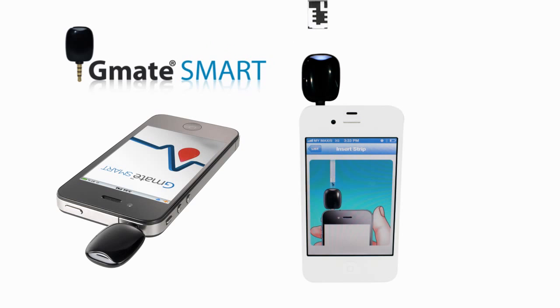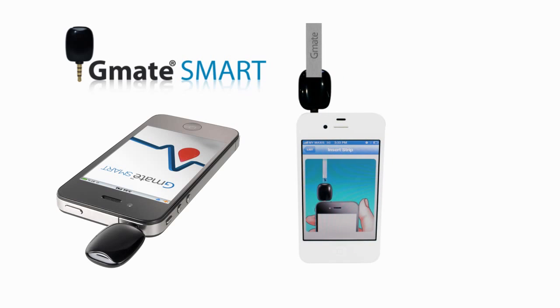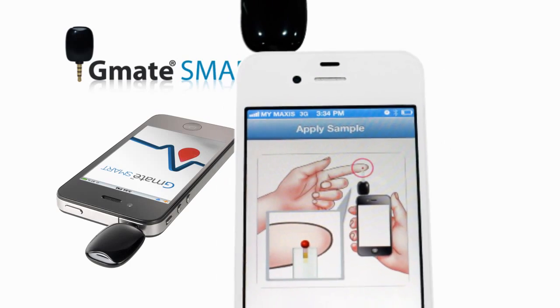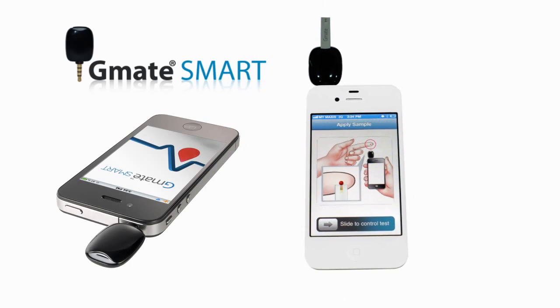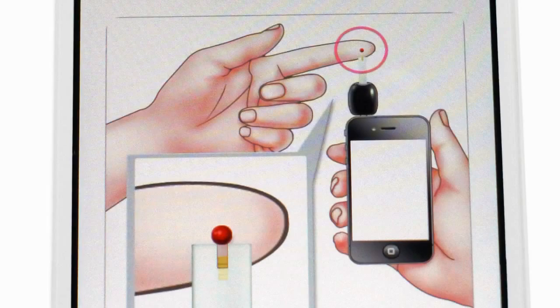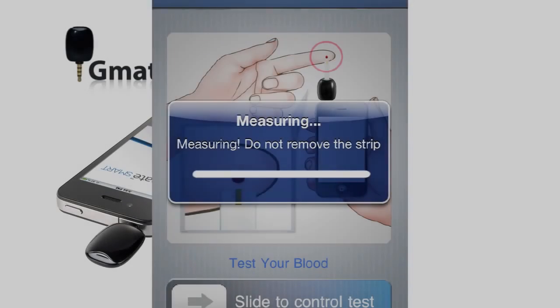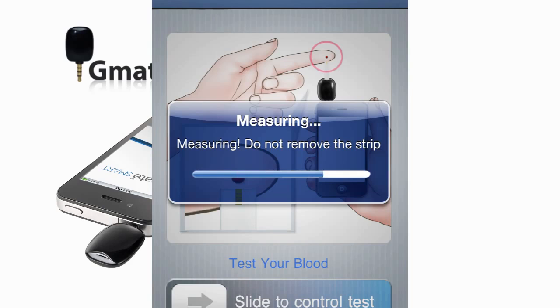Insert the test strip using gentle pressure. Do not force the strip into the meter. An Apply Sample prompt will appear to let you know the meter is ready to be tested. Bring the tip of the strip to lightly touch the drop of blood. The application will show a countdown within 5 seconds.